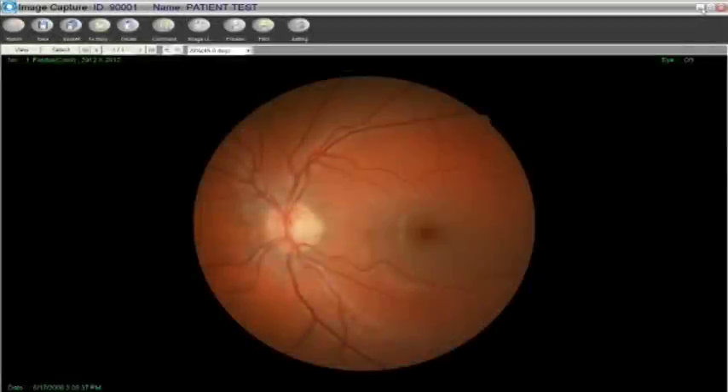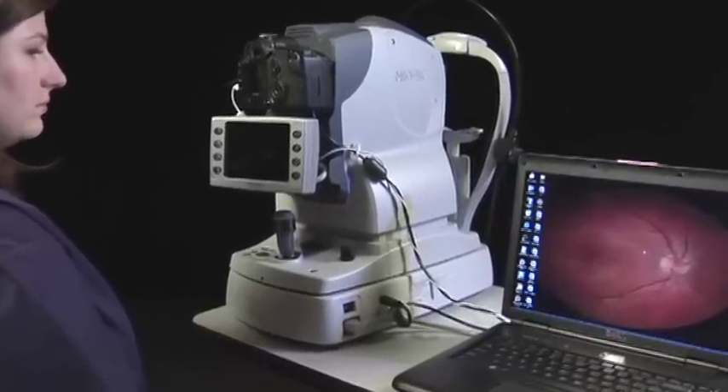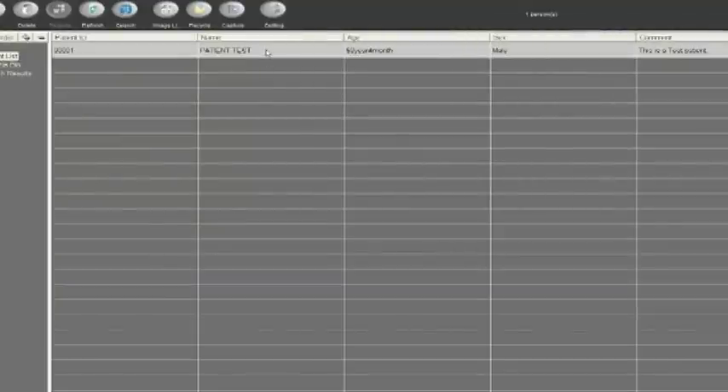When the image is transferred to the computer, select Save All in the software and close out the image capture screen by the red hex. Double click on the patient's name to view all of the retinal images.